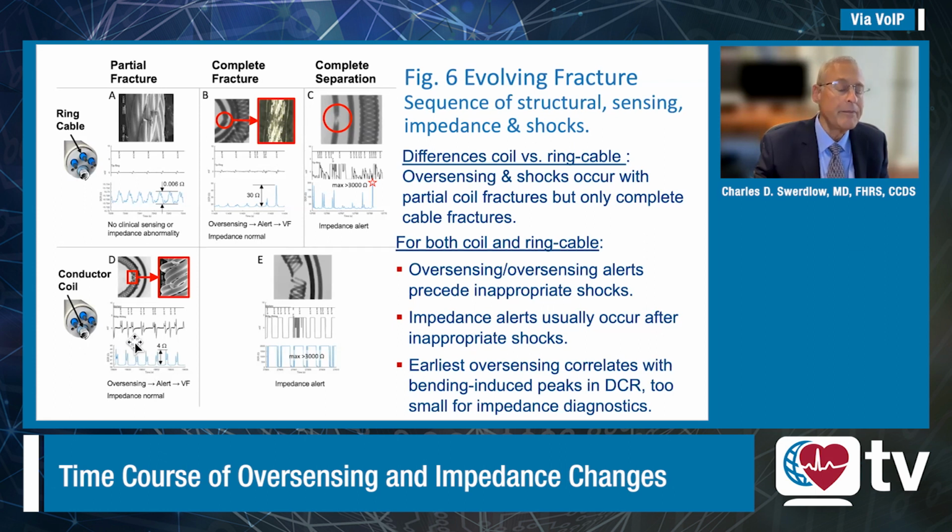However, similar to the ring cable, this can progress to more frequent oversensing and inappropriate detection of VF by the device, even with a normal impedance. And in fact, it is not until the lead completely fractures, not until the coil completely fractures, and when the coil does fracture, it separates, that we get an impedance alert.